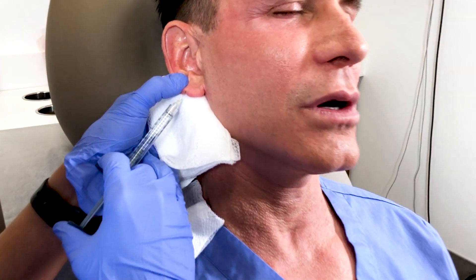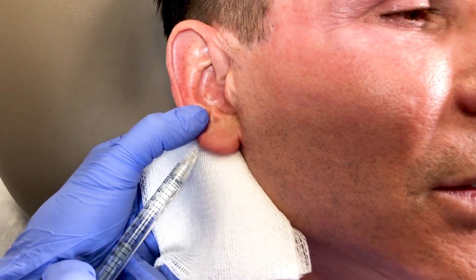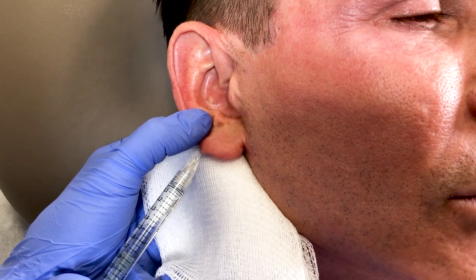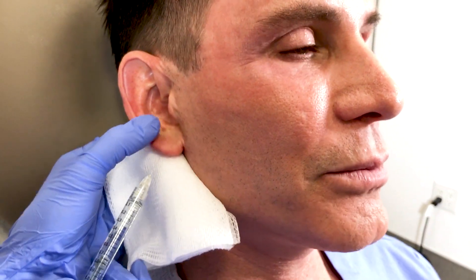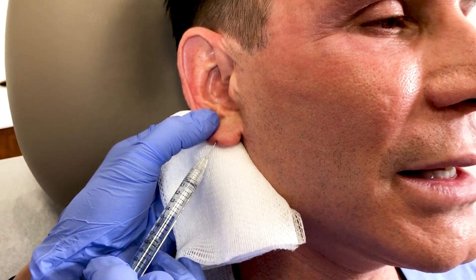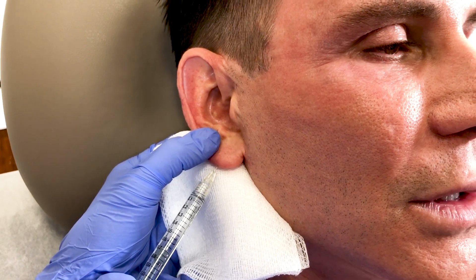Juvederm is great because it has anesthesia in it as well as the filler, so it's not very painful. The nice thing about earlobes is it's not really painful to inject at all — she's injecting the filler right now and I honestly don't feel anything. I'm pretty much a baby when it comes to pain, but truly there's just a little bit of a pinch.